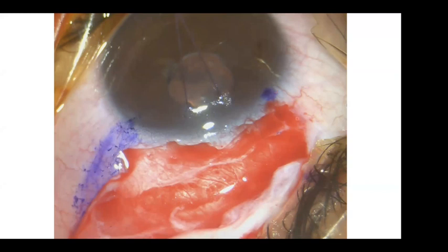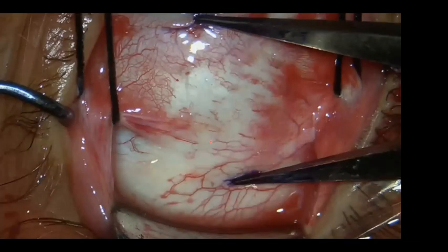And why do I do that? Because sometimes the eye rotates and then you are confused. Where is the lateral rectus from the inferior rectus? And believe me, that could happen. So to make it easier for me, while I'm at the 12 o'clock position, I do markings of the lateral rectus and the superior rectus. And then I mark the place of the tube, which is supposed to be here. This is not definite, but again, it is just an expectation.